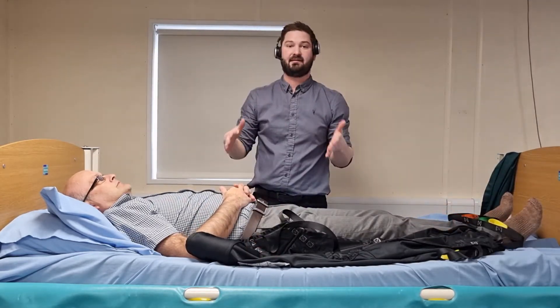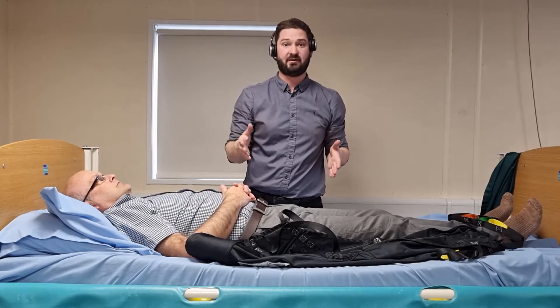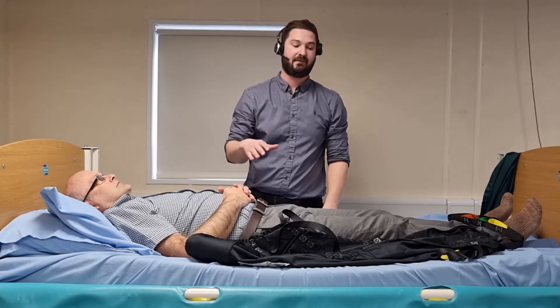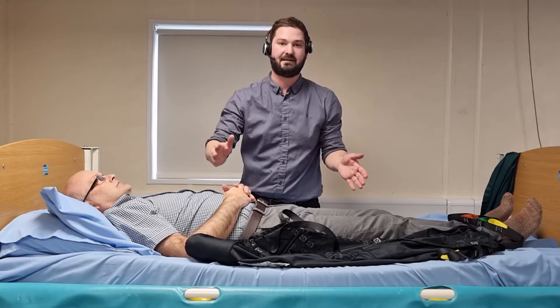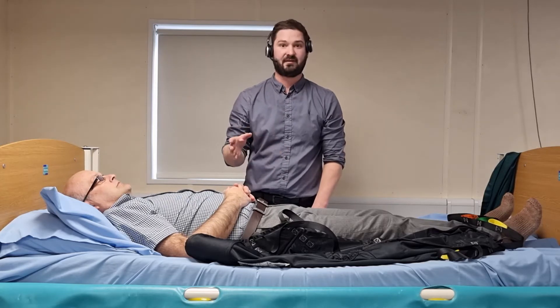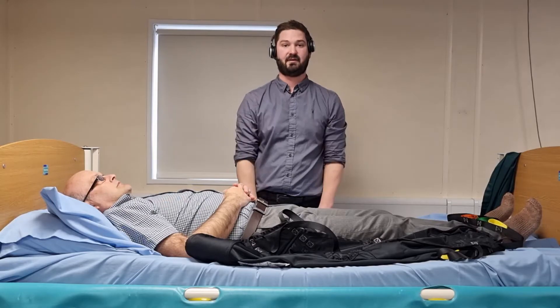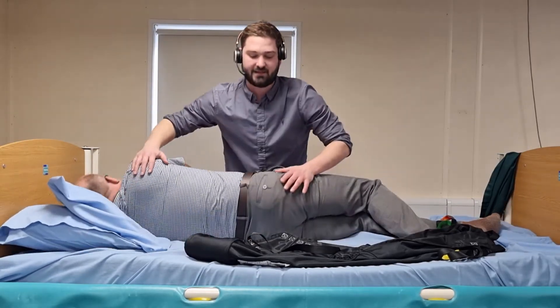I'm going to ask my person to roll towards me. For the purpose of the video, this is going to give you a clear view of how the sling is fitted underneath him. If I was going to ask my person to roll away from myself, I'd need to ensure that the opposing side of the bed was secured — either with a side rail, or in a domestic setting the bed might be pushed up against the wall creating that security. So I'll ask my person to just roll over into side lying.